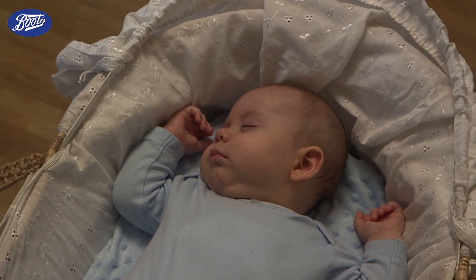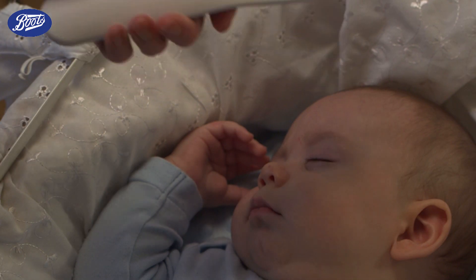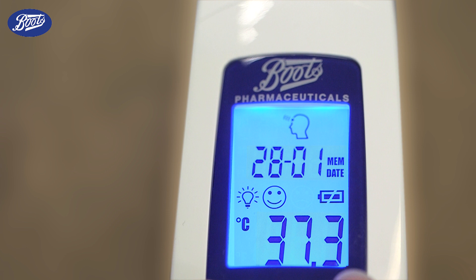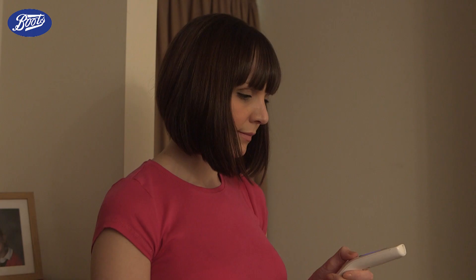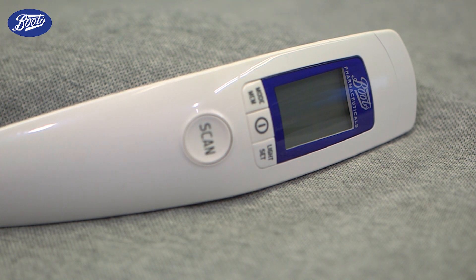You can also adjust how illuminated the display is depending on the darkness of the room, and you can store the last 60 readings to allow you to track your child's temperature changes when they're ill. The Boots Non-Contact Thermometer has clinically proven accuracy, making it just as effective as normal thermometers.